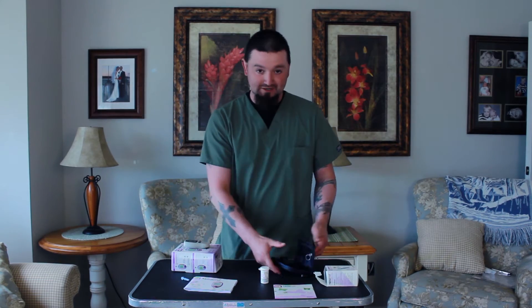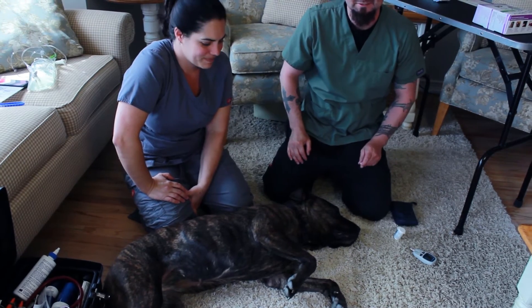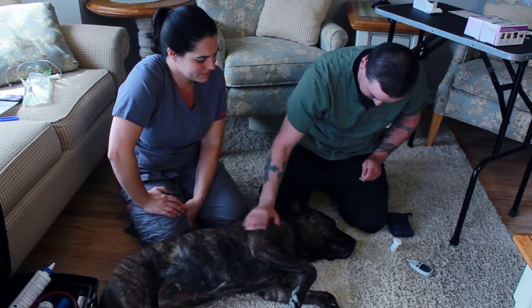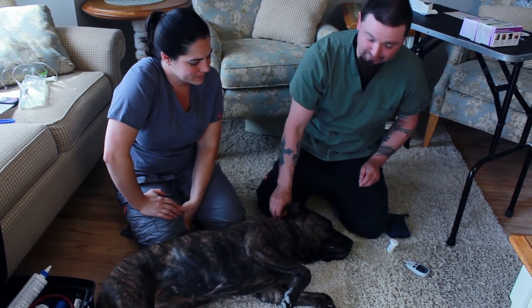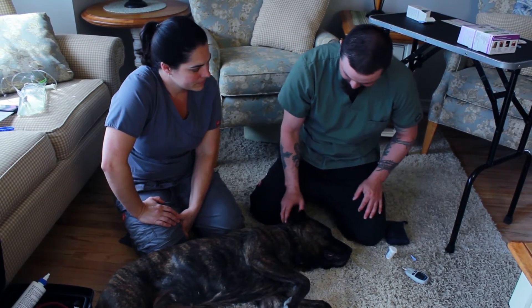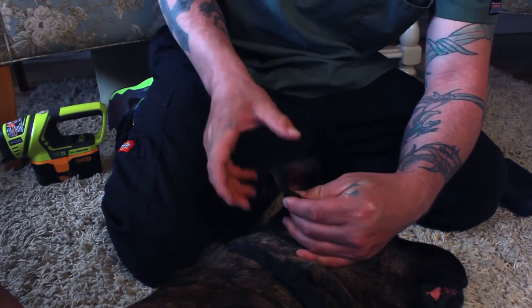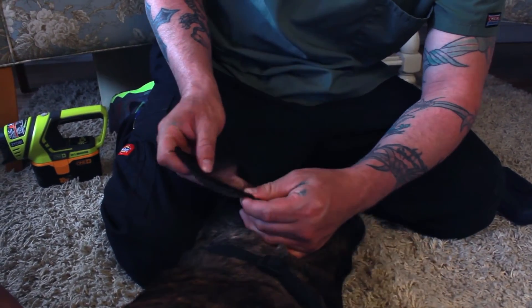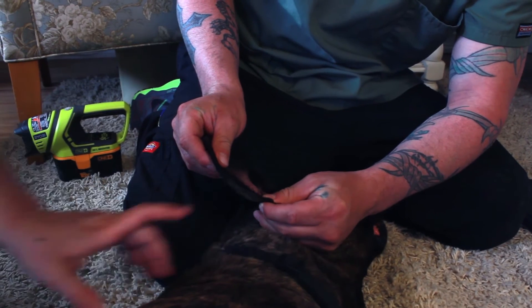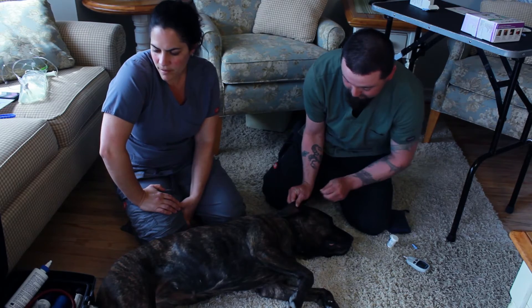The next thing to do is grab a patient and see how they tolerate it. This is Bella, Dr. Lisa's little rescue pup. What we're going to do is show you a couple of different areas to take a sample from. You can always take a sample from an ear — along the edge of the ear there's a vein which you can slightly press up on, allow the vein to fill with blood, and take your little sample.